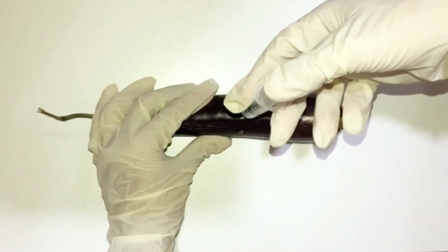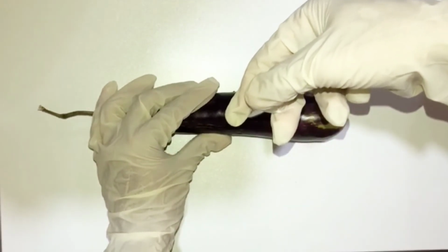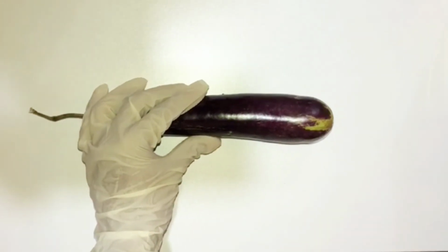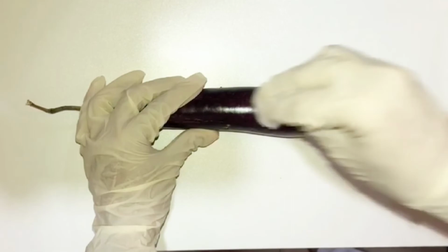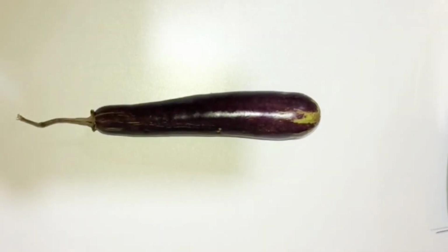Since there is no blood, let us now proceed. Release the skin and place a cotton pad on the site. Apply gentle pressure but don't massage the area. Now throw away the syringe that you used. Remove the gloves. And perform hand hygiene to deter the spread of microorganisms. And lastly, place the patient in a comfortable position and document the procedure.